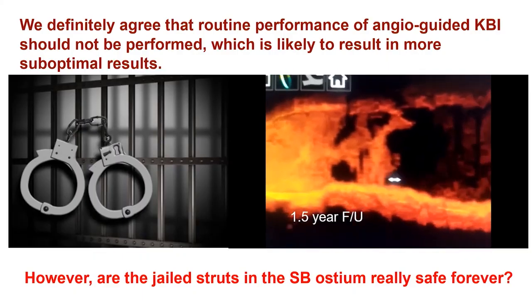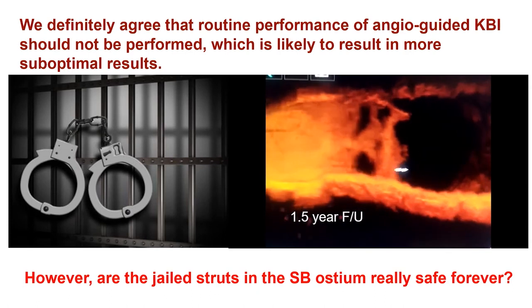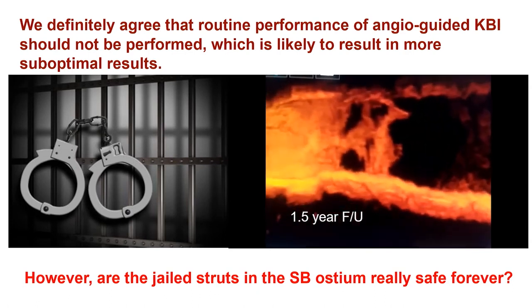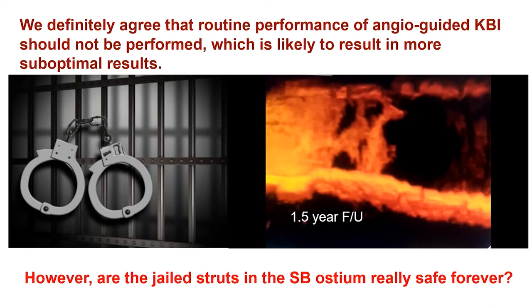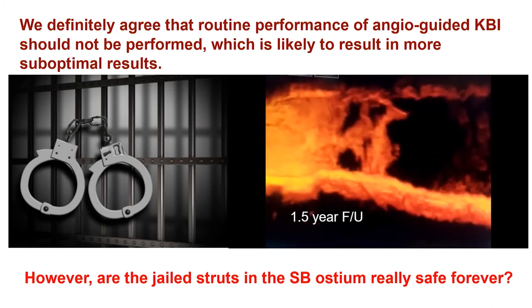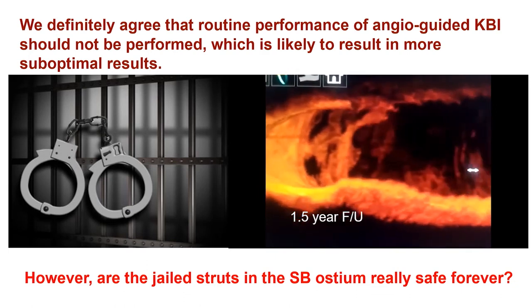In one-stent deployment in the bifurcation region, we definitely agree that routine performance of angio-guided kissing balloon inflation should not be performed, which is likely to result in more suboptimal results. However, according to the OCT follow-up studies, we fear the following. Are the jailing struts in the side branch ostium really safe forever?